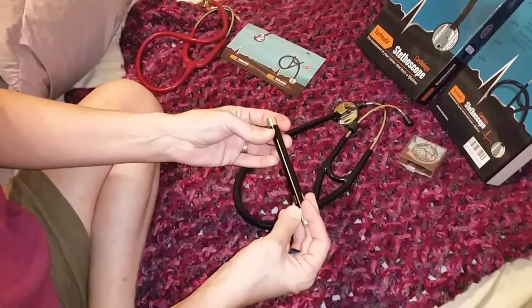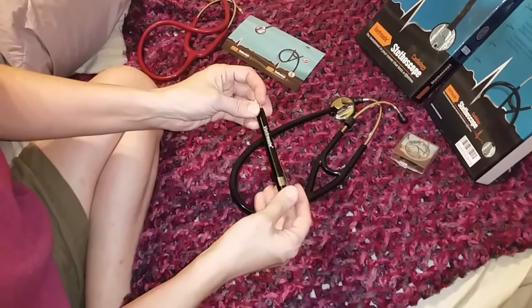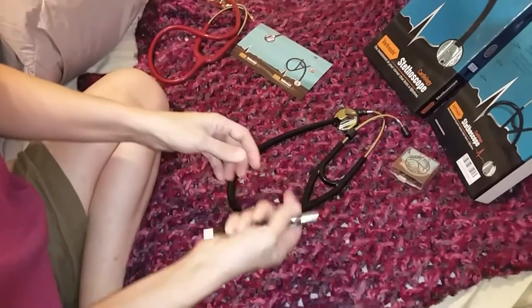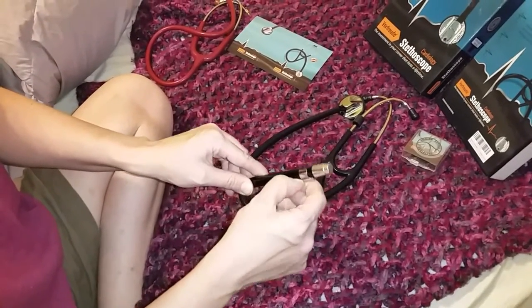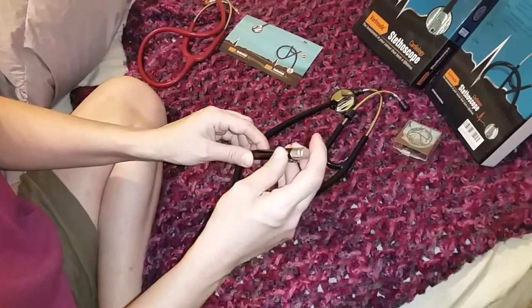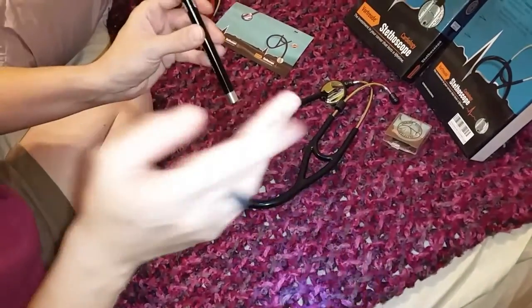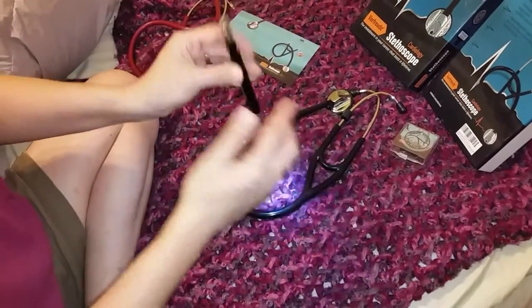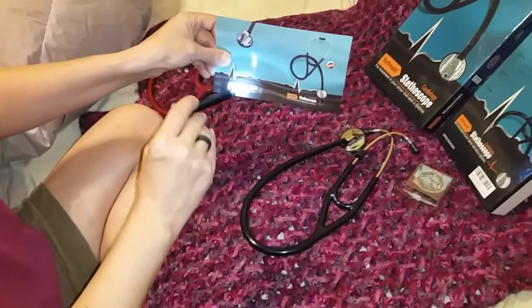Now, the penlight. This is a nice little bonus that's included. It doesn't have a pupil gauge on it — that's okay, not that big of a deal. This is heavyweight. It's got a clip on it, so if you just want to stick it in your pocket, you can. It's very, very bright.